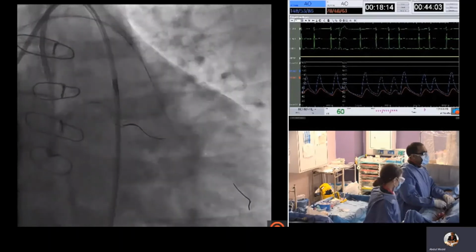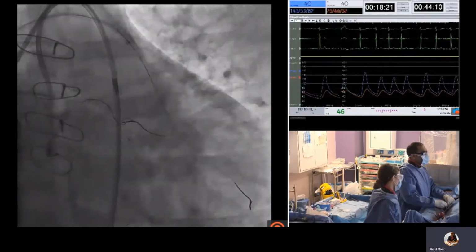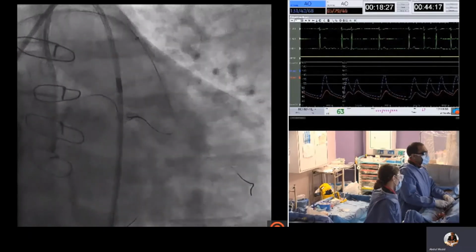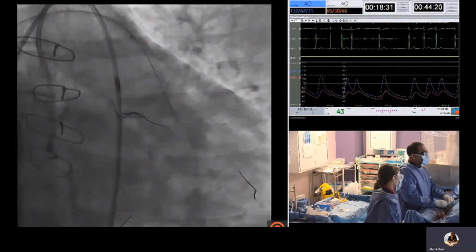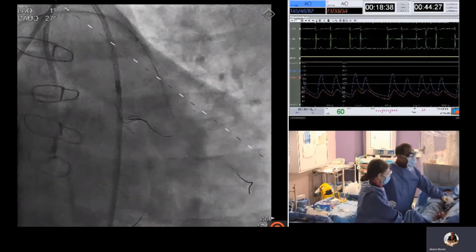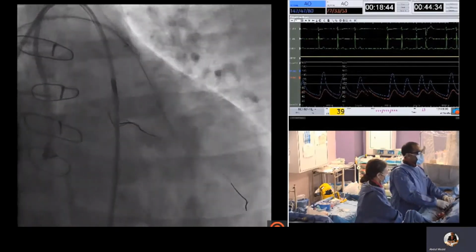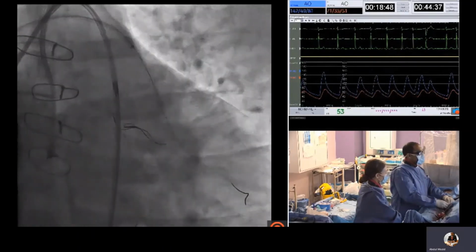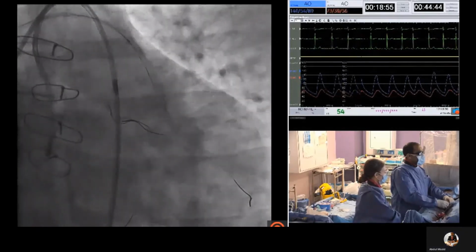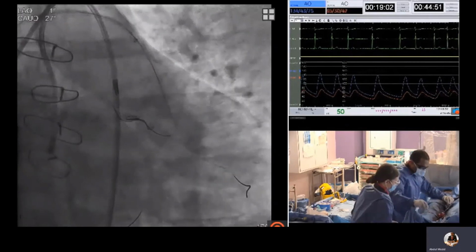And so here we are. We have managed to direct a wire into the proximal cap. This was a Gladius wire by Asahi, which is essentially a steerable form of the Pilot 200 wire with the Asahi ACT 1 technology. And here you can see the antegrade wire is now overlapping the retrograde equipment, and we try and push it on to form a knuckle, so that we are hopefully in the same space as the retrograde equipment.